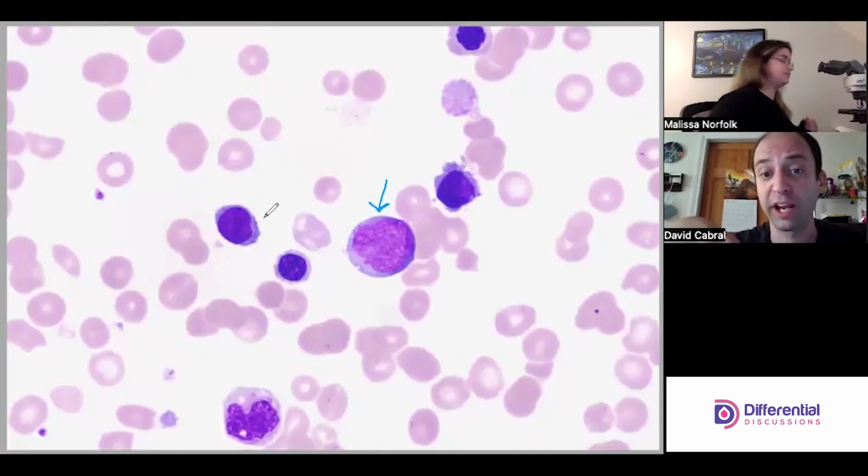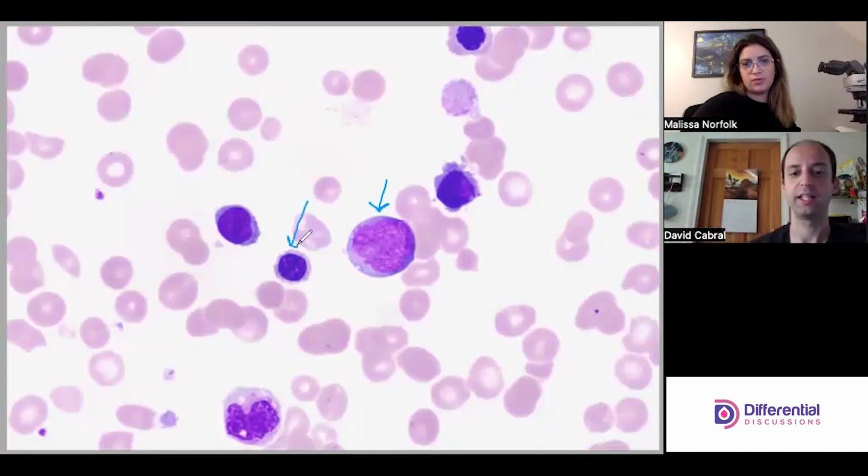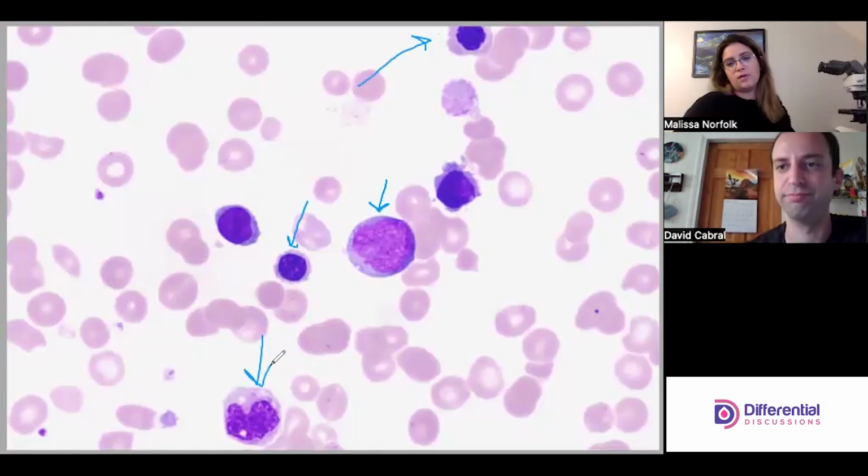Unfortunately. And then we have a nuke, right? We should point out the NRBC. We have an NRBC here. And then a meta. We have one there in the fields. And then we have this guy down here. He looks like a meta. Agreed.